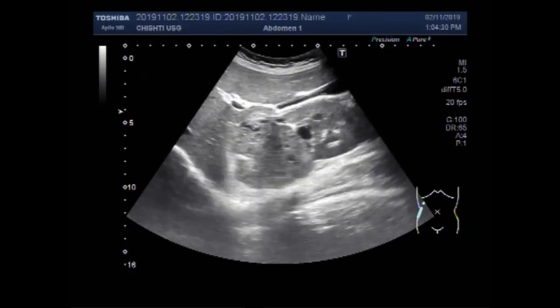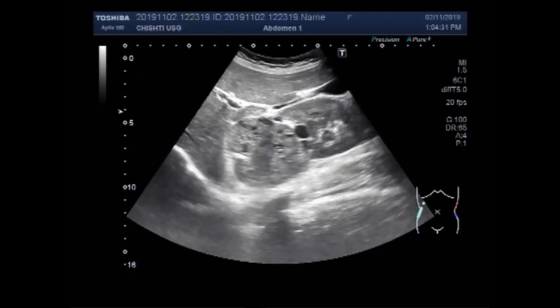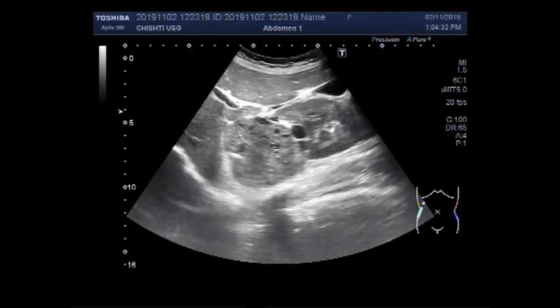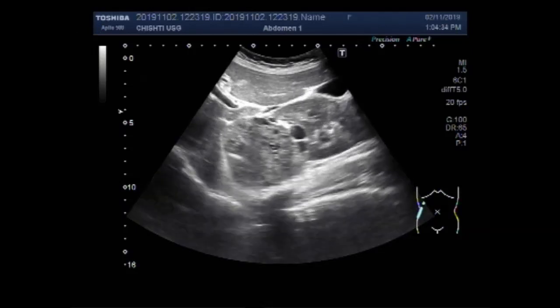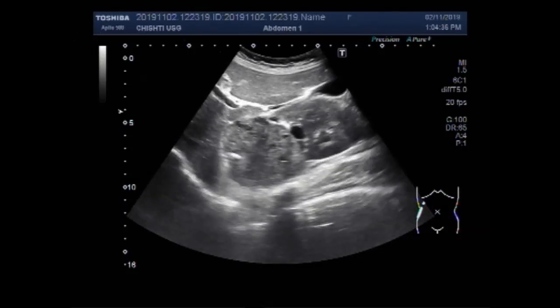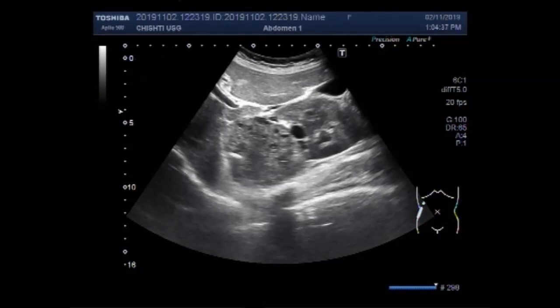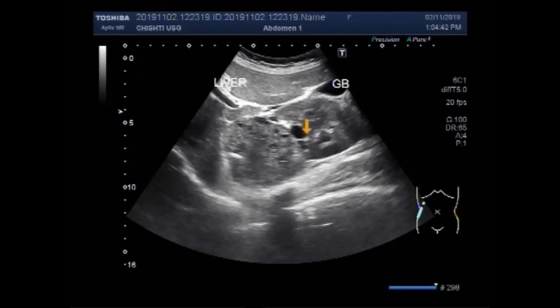You can see the right kidney, liver, and gallbladder, and the mass. This is the liver, this one is the gallbladder, this is the right kidney, and this is the mass.